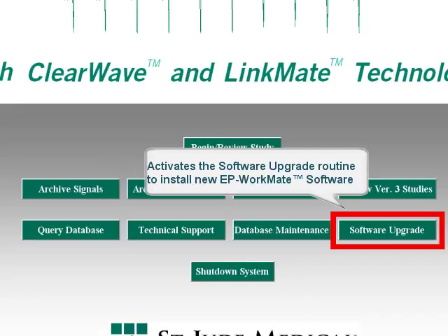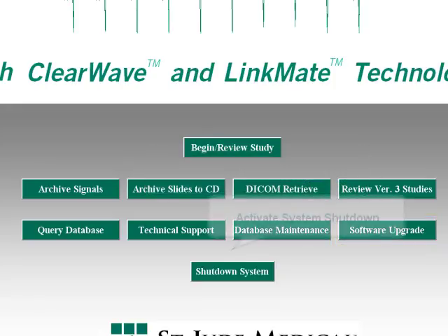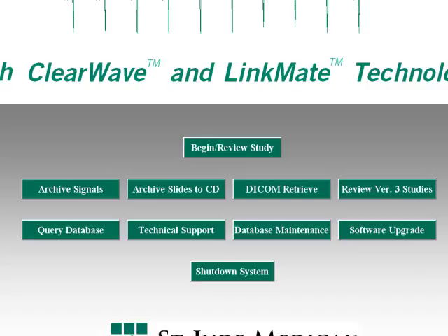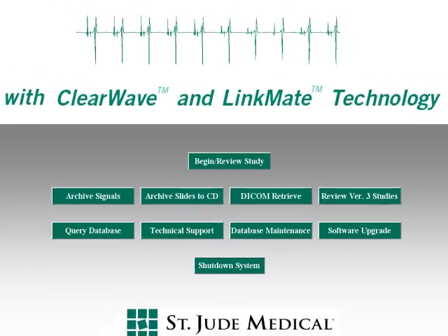Software upgrades are typically sent out on CD, and the software upgrade button activates the software upgrade utility to install them. The Shutdown System button activates the Windows system shutdown to power down the main computer. The Review Version 3 Studies button allows a customer with Version 3 studies on a server to access and review those studies. The Archive Slides to CD option allows the user to automatically create and burn a CD with images and screenshots saved from an EP Workmate Recording System study.